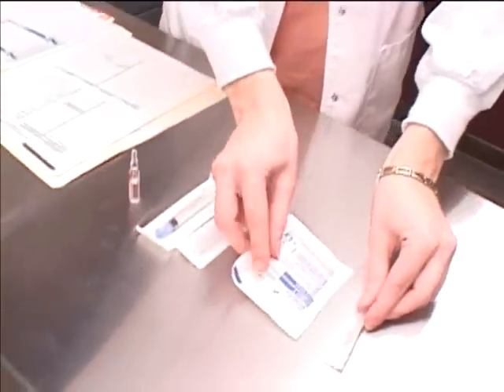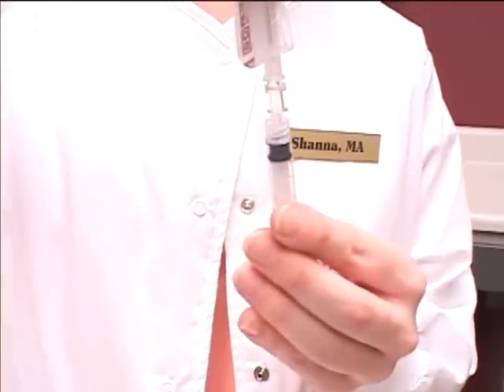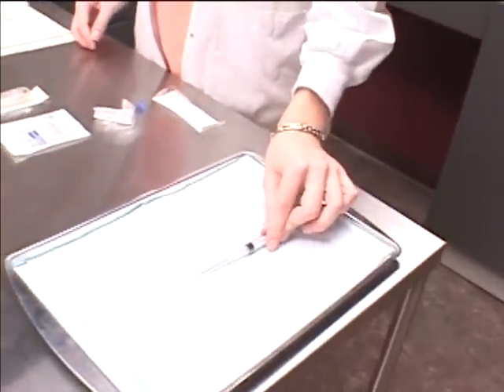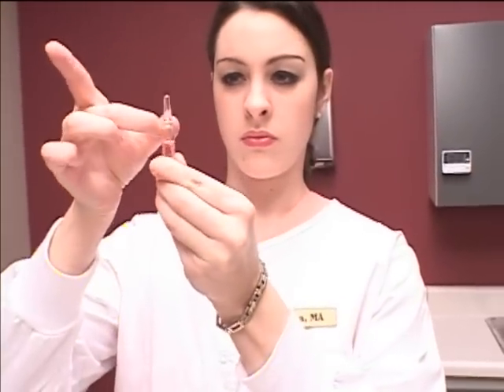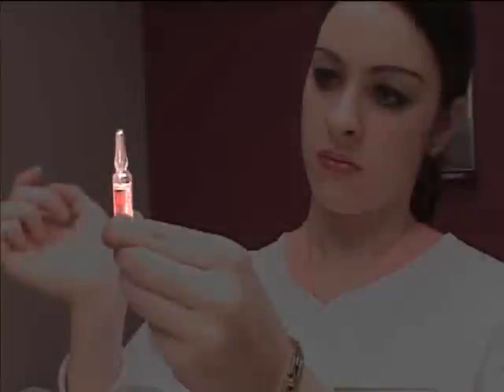Put aside a sterile gauze pad to use to prevent you from being cut on the jagged edge of the broken ampule. Open the syringe and attach the filter needle. Place it down on a clean surface. Check the ampule for the location of the medication. If the medication is trapped in the top of the ampule, flick the neck repeatedly with your fingernail while holding the ampule upright to move the medication into the body.